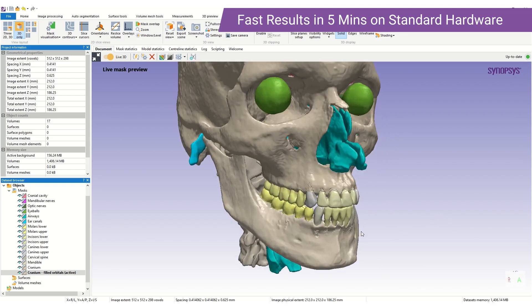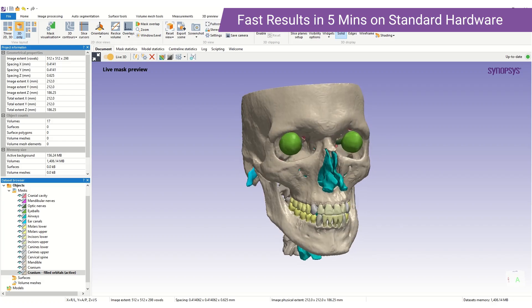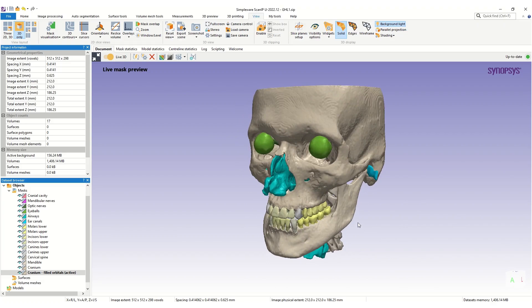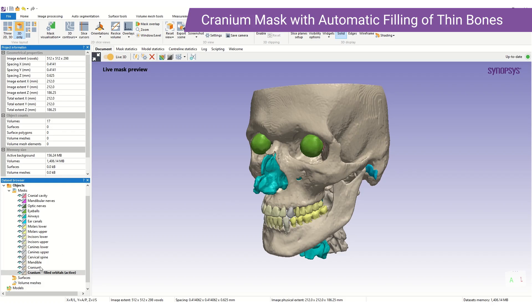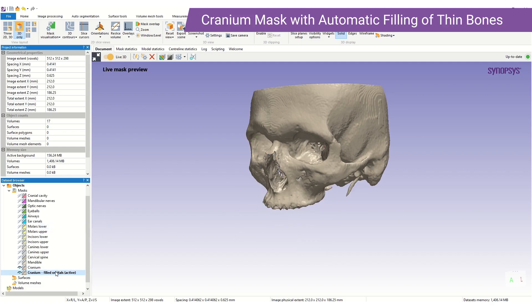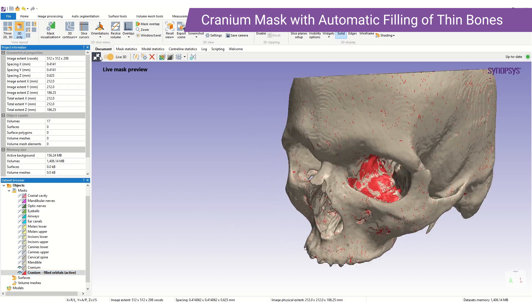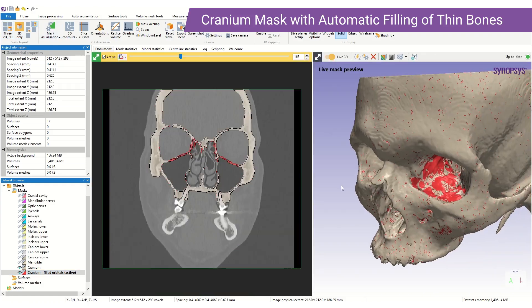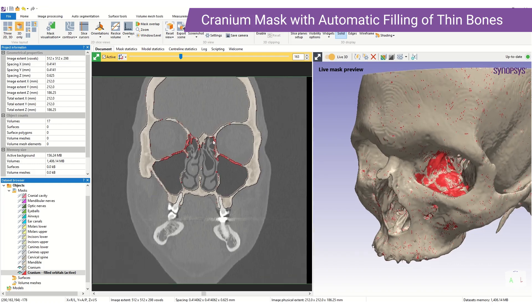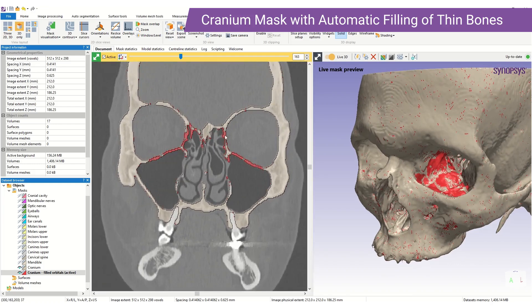As you can see in this output we have the split teeth option on. One major advantage of our tool is the generation of a cranial mask which has automatic filling of the thin bone within the orbits. We can see this difference by looking at the two cranial masks. As you can see in the filled orbits option the thin bone structures have been filled, whereas in the approach using just thresholding techniques it is not. This is extremely useful in 3D printing, simulation and surgical planning.